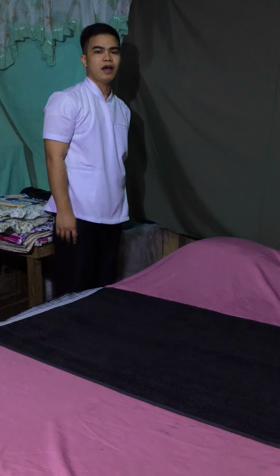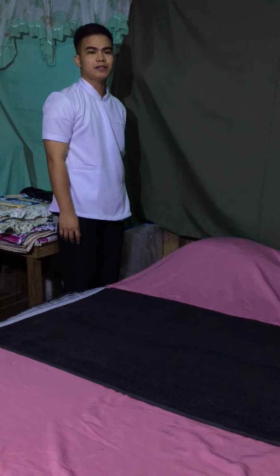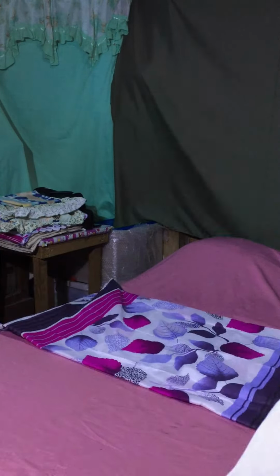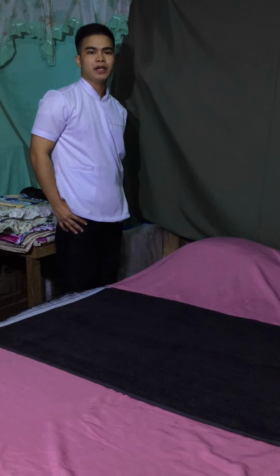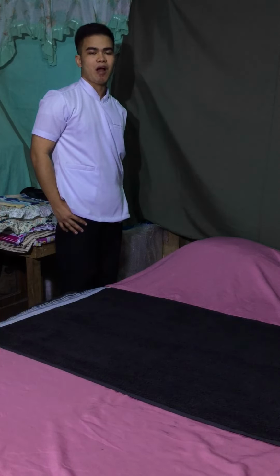Tuck the sheet in the side. Then, complete the process for the draw sheet, for an orderly procedure. Then, place the top sheet hem side up on the bed so that its center fold is at the center of the bed and the top edge is even with the top edge of the mattress. Unfold the sheet over the bed. This ensures appropriate coverage.